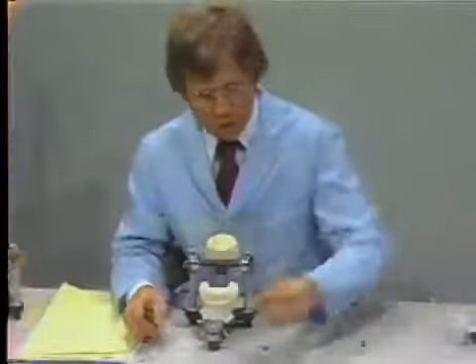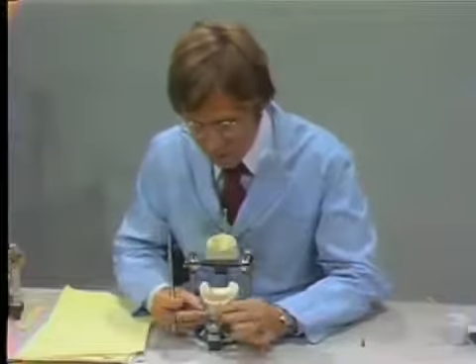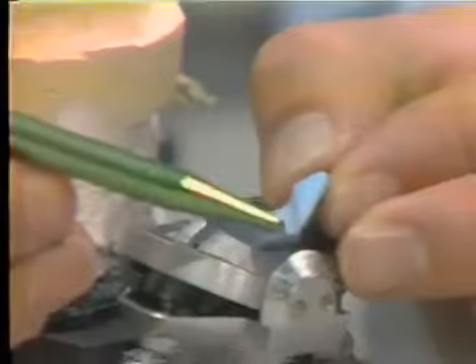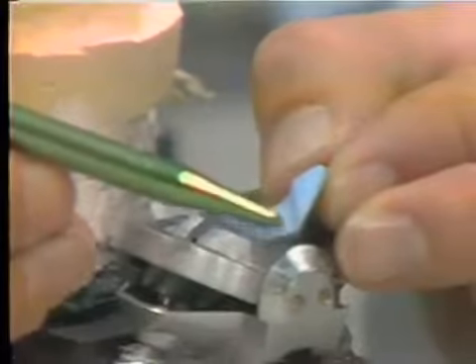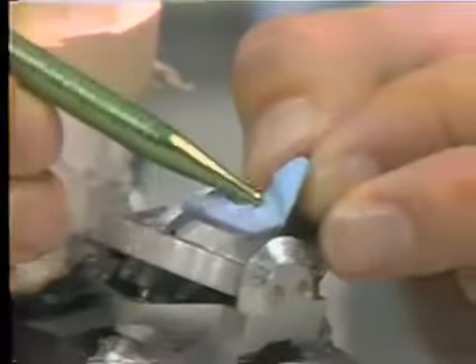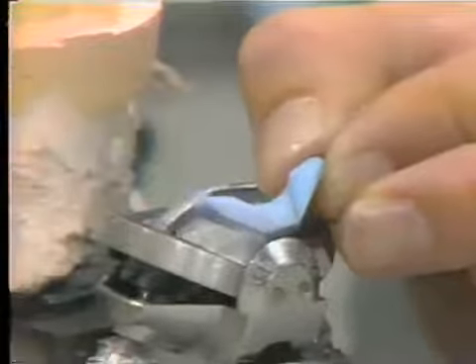And after you trim it, it should look something like this. You see, the incisal pin rides up in the protrusive fashion, and then beyond the end-to-end relationship, it is sort of flattened out. So it is not incredibly steep.